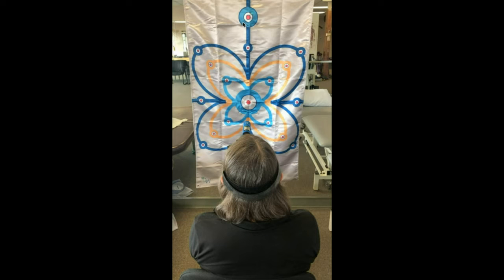Now, the same with all of our testing. As we go through this, if it makes her dizzy, I want to know that. We're going to do a general test for approximately 10 seconds. But remember, treatment can be up to 1 minute several times, with the idea of stimulating them mildly. And if they do get stimulated, you might have to have them rest for a while to recover, and then try that again, depending on what their symptom presentation is. But let's just roll this video and see what we see together.